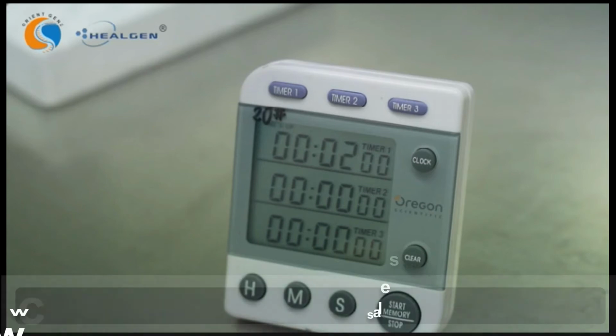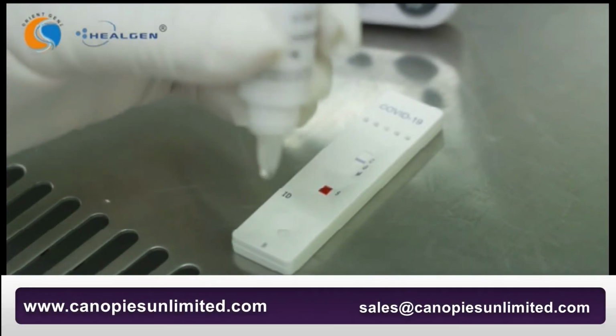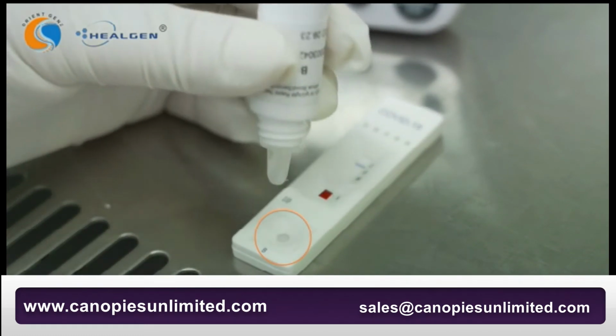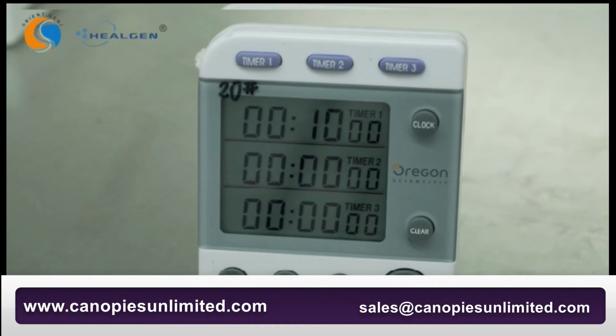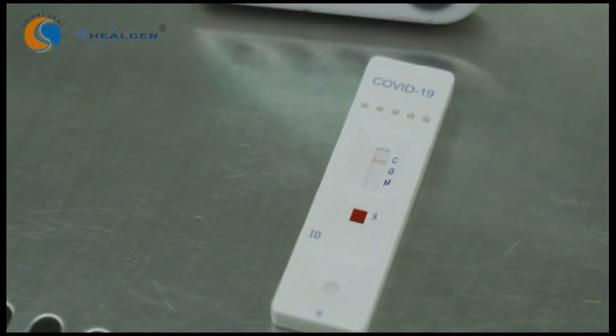If, after 2 minutes, the sample has not moved across the test window or if blood is still present in the sample well, add 1 additional drop of buffer to the buffer well. Read the test result in 10 minutes. Do not interpret the results after 15 minutes.